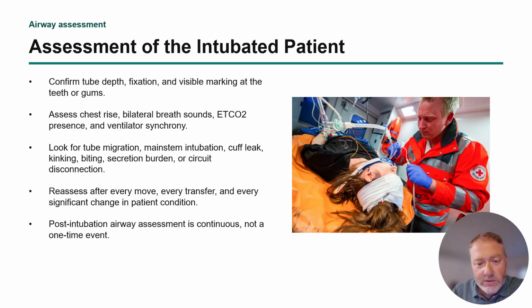So safe levels we teach at 20 to 30. And that, I believe, has not changed. So, anything between 20 and 30 for a cuff pressure. I don't know if you guys use cuff pressures on the bus, but if not, it would certainly be something to look into, I would say, because managing the ET tube cuff is paramount.